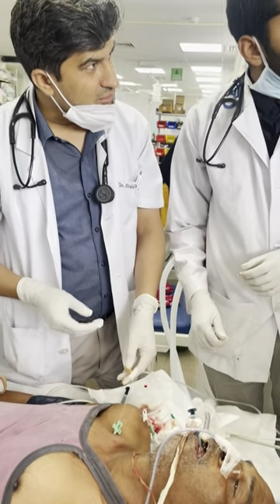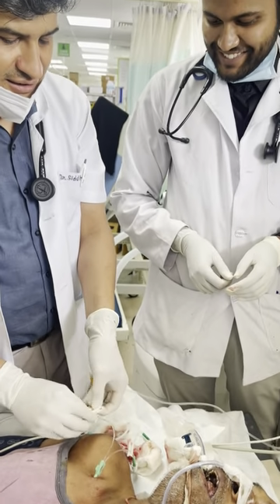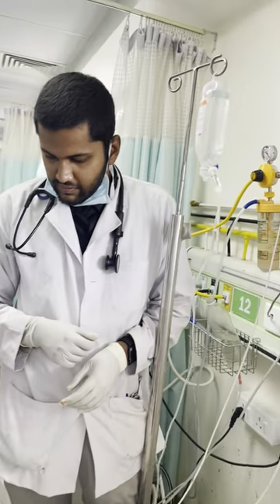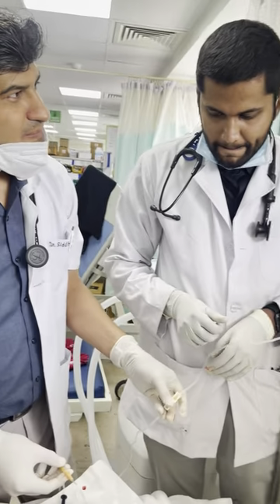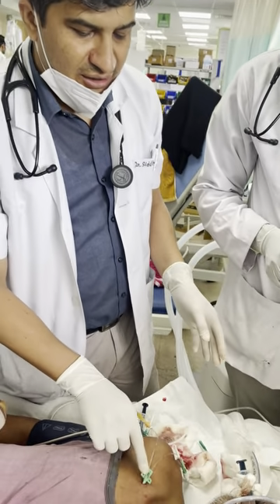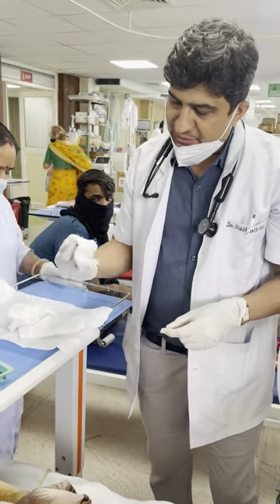Why is it going so slow? Because it is locked. And how much is the flow this line has? This line has around 100 ml per minute, as high as. So I am giving patency. Now you will clean it with betadine. Take one pad, smaller one.